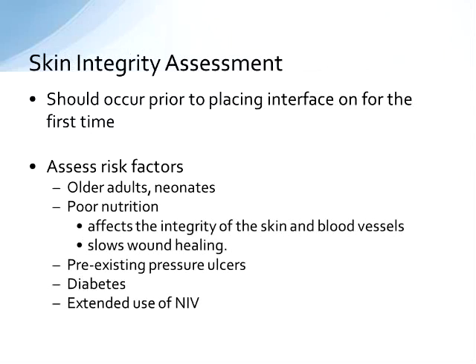So we need to be doing skin assessment. We need to look at the integrity of our skin, being really attentive to these little guys, particularly those that might be considered at high risk or have several risk factors. So you should look at their skin before you ever put the mask on their face and make sure that the skin is intact.